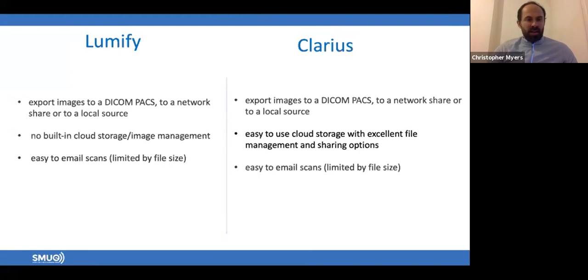You can share to Clarius. You could add a reviewer, which is quite useful. So I can share this with, say, my clinical supervisor if I was doing a postgraduate certificate or mentorship program. You can also write the report. So you can just, no long-headed biceps, you can write your indications, your findings, and straight away you've got your images. So there's lots of nice usability here.